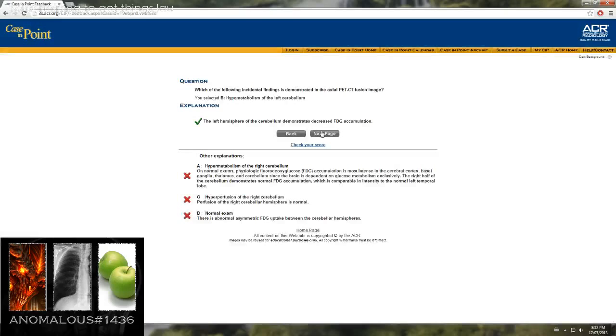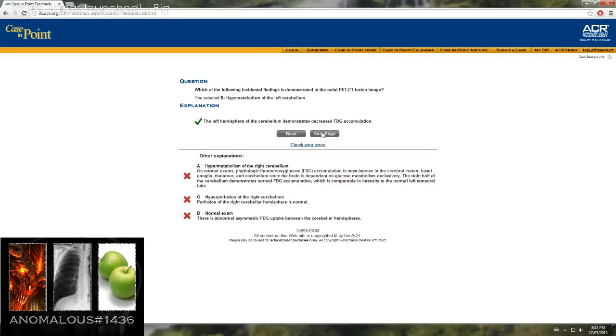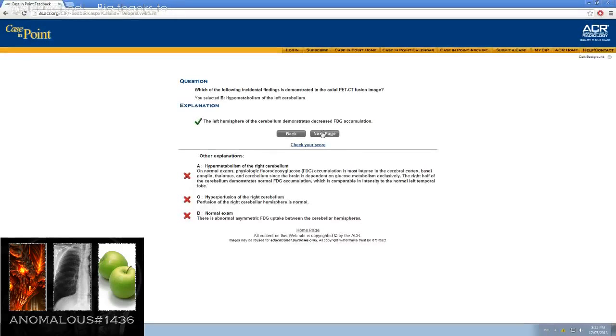In that case, the left hemisphere of the cerebellum demonstrates decreased FDG accumulation.